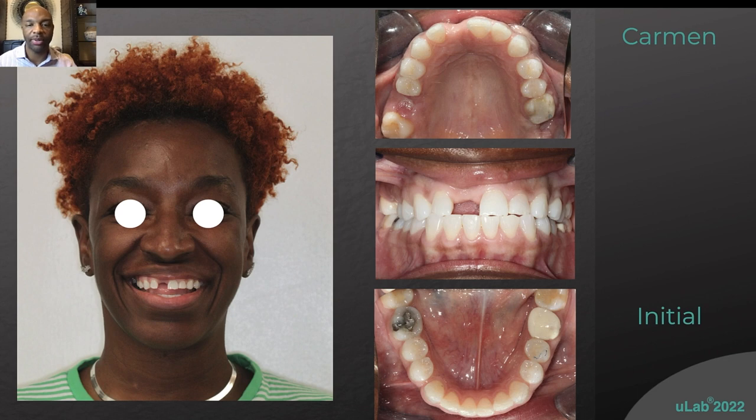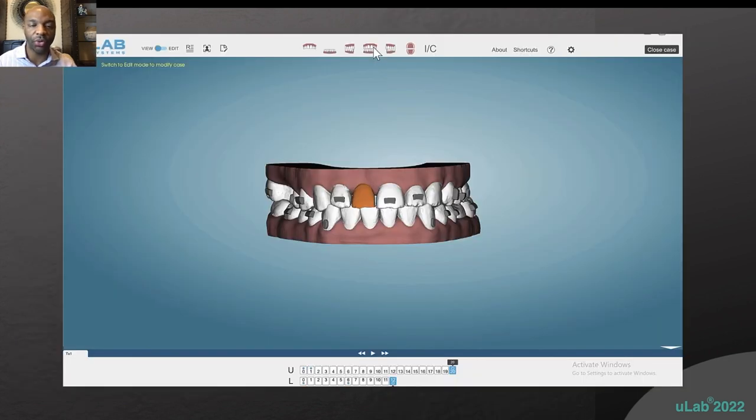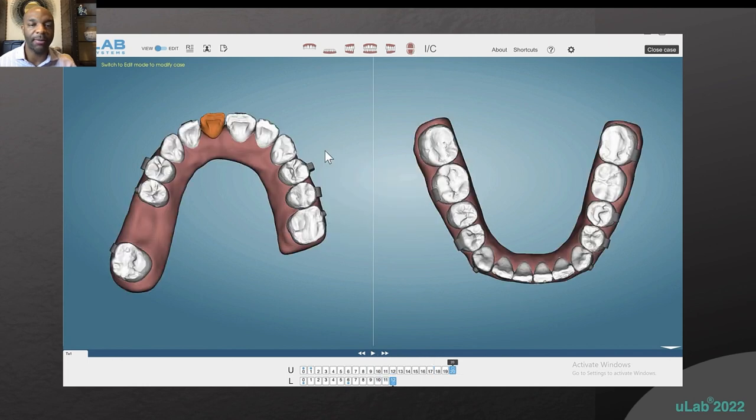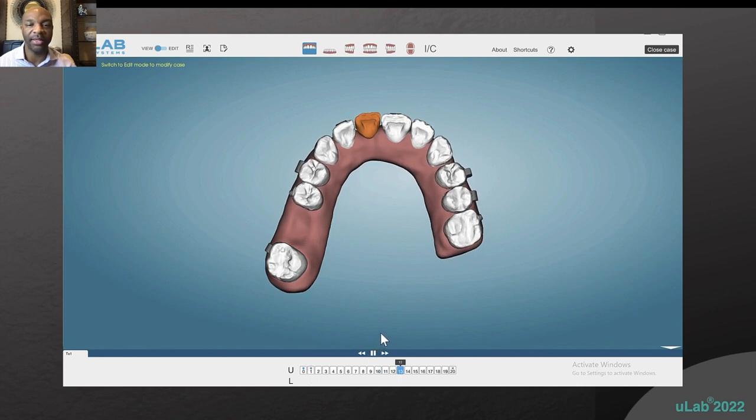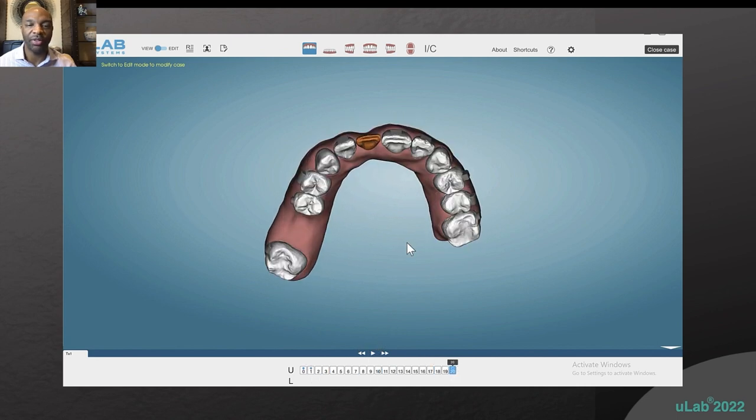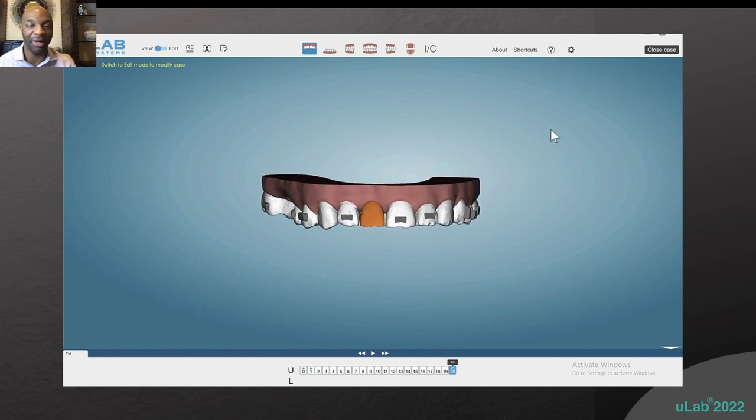This is how she presented and how she came in. During treatment, you can put the pontic in and have it for the entire case — it's very simple. You just click the pontic button and it puts it right in. It's very straightforward — not a lot of work. You can extrude it, make it wider, make it longer, whatever you want to do.